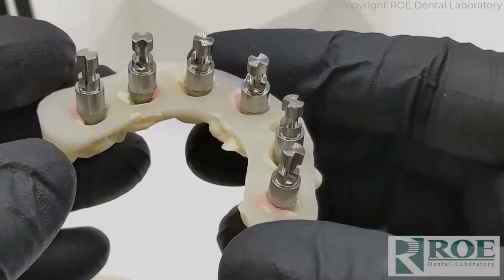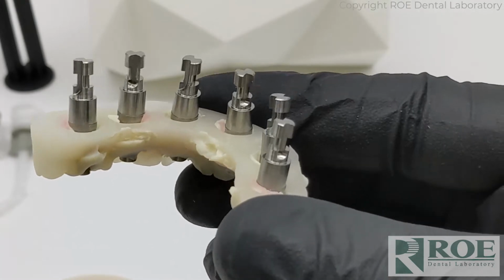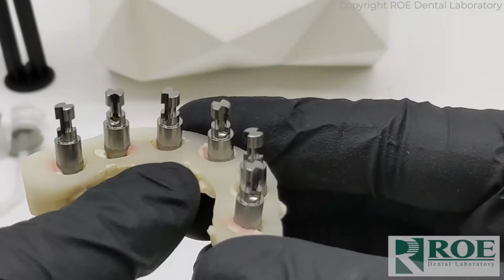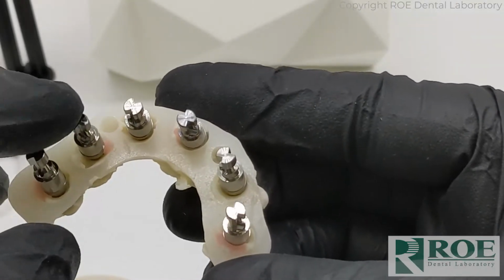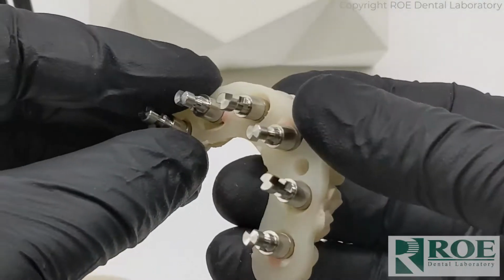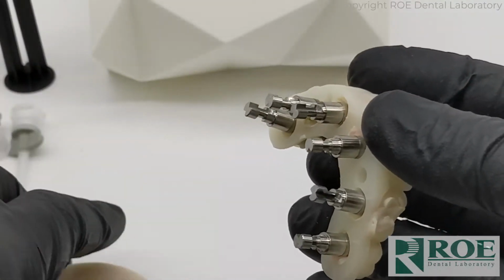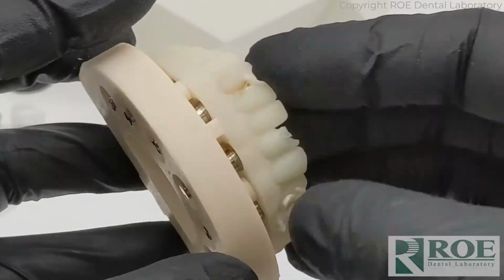That's very important because sometimes the material gets in here. When you bring the RAPID Appliance back into the laboratory, sometimes you're filling little holes to reinforce it, in the occlusal or in the intaglio, and you can get some material in this. So be very careful that they're totally flush down. Otherwise, obviously the parts are going to be in the wrong position, and surgery and the prosthetic won't be passive.